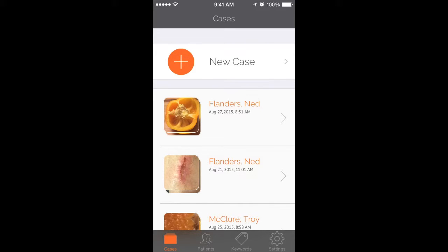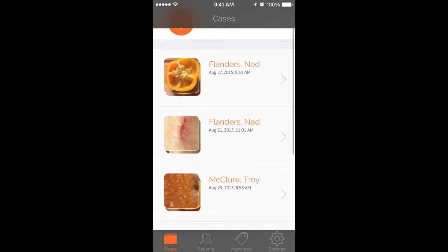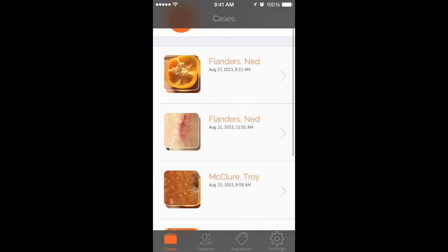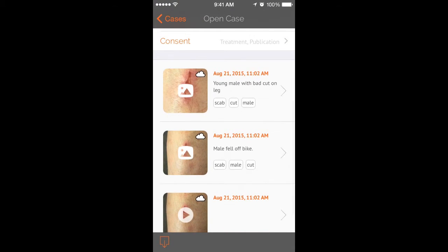As you can see in this cases module, I have two separate cases for the same patient. What has happened is he's come in to see me twice for two separate things, so not only is this all linked under one person's name, it's linked under two separate cases. If I were to click on the bottom case, you can see that I've added descriptions and keywords to the images that I have here.